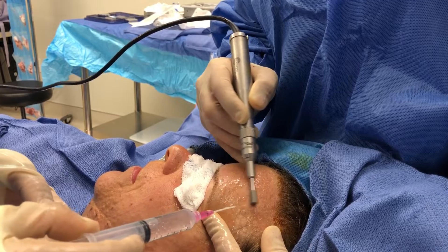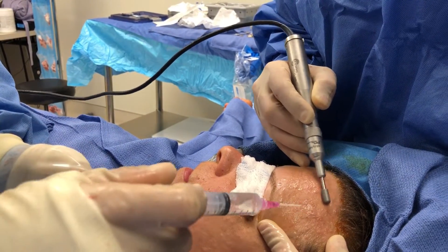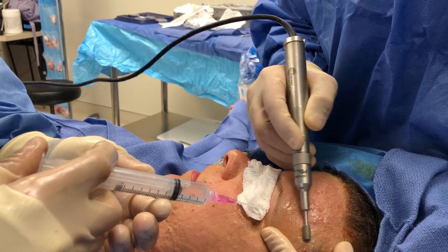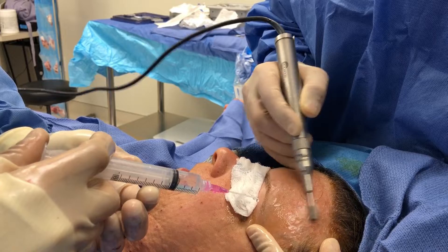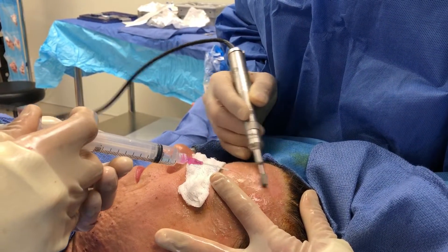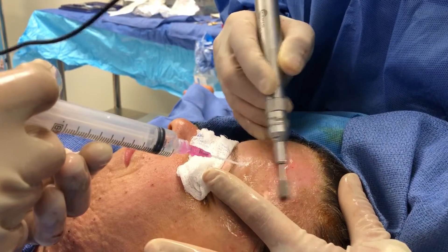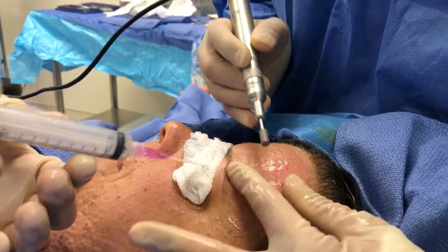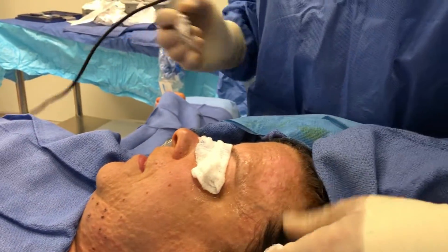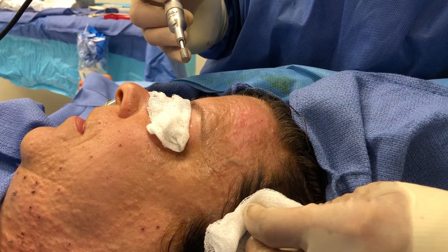We like to make sure it's nice and taut. This is just taking out the outer layer of skin and down to the deeper layers of dermis. You can kind of see the color change happening a little bit — the nice fresh skin is underneath there. We just want to make sure we're constantly passing this over the skin. We'll give it a little wipe and see what that looks like. You can see a little bit of what's called pinpoint bleeding — we really like that. On a closer look, we can see there's still some texture problems there, and we need to concentrate on those little spots a little bit deeper.